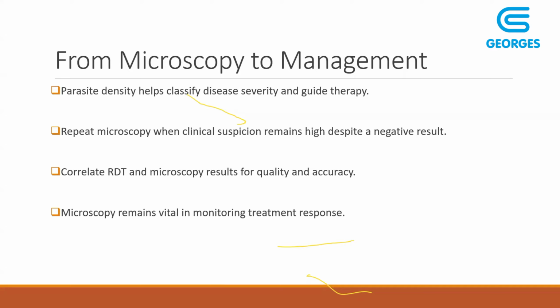And then you can correlate RDT results, not only RDT. If you are able to do PCR or other methods, you can correlate them with microscopy for quality and accuracy. Then remember, microscopy remains vital in monitoring treatment response.